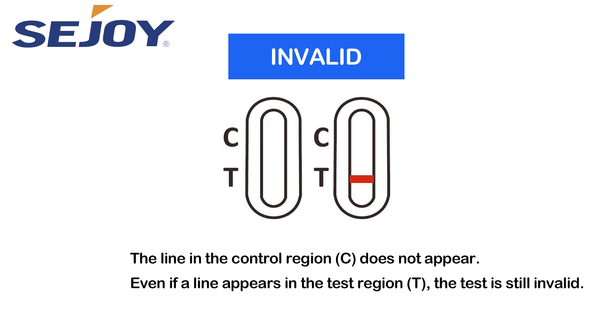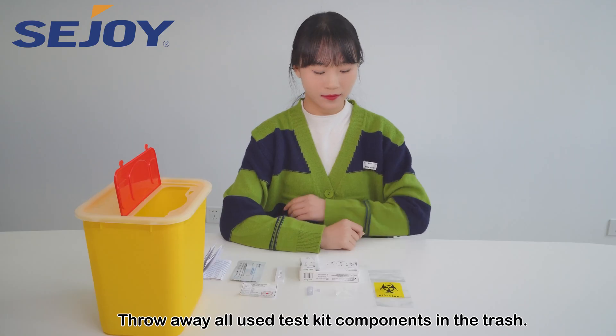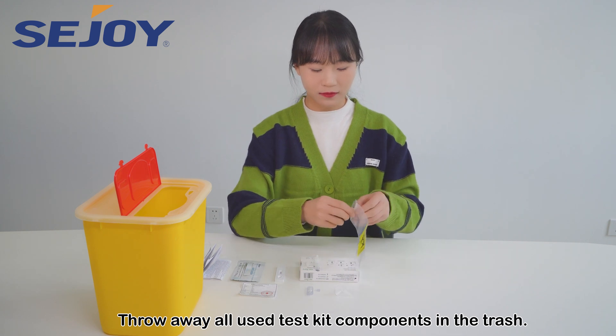Invalid: the line in the control region C does not appear. Even if a line appears in the test region T, the test is still invalid. Throw away all used test kit components in the trash.